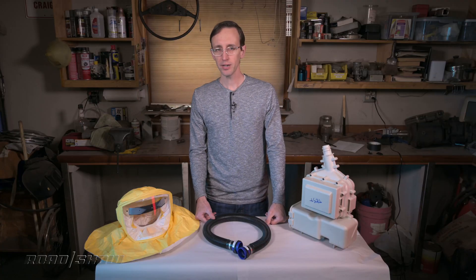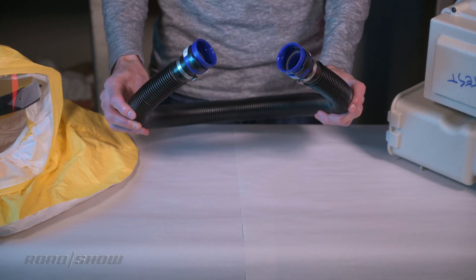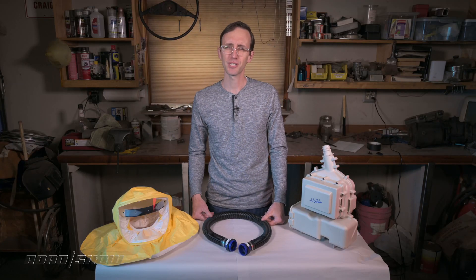As you can see, these things are made of a few major components. You've got the hood, which you wear on your head. There's this small section of tubing and, of course, the main unit itself, which you kind of wear like a backpack. I'll show you how all of this goes together in just a minute.